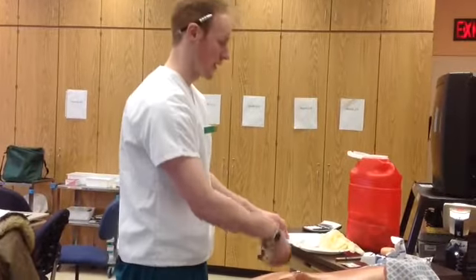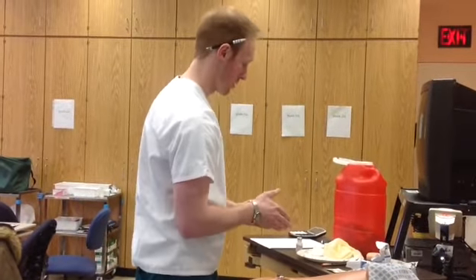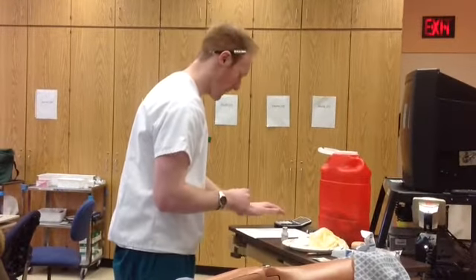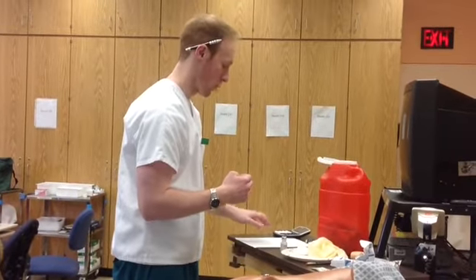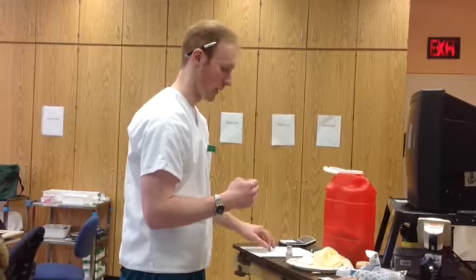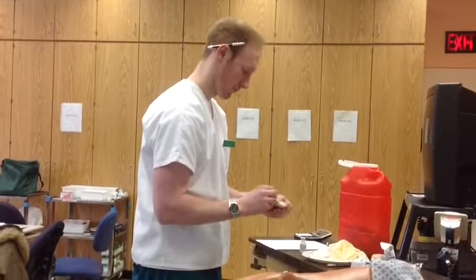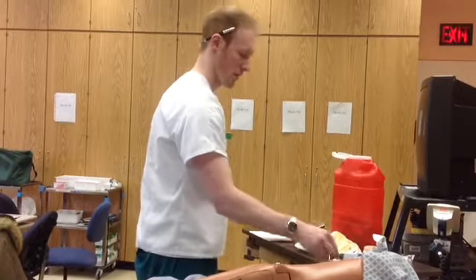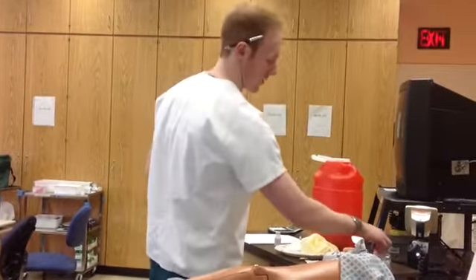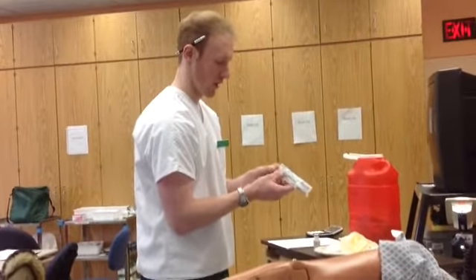So I'm going to take the medication out of the drawer, and I'm going to do some math. So I'm going to do my math out, then I'm going to verify it with another nurse, and it looks like I'm going to need to take up 1.2 milliliters of the Bicillin. So I'm going to take my alcohol wipe, clean off the top of the vial, let it dry. At that point, I can grab my syringe, which is going to be a 3 mL syringe, 23 gauge, 1-inch needle.